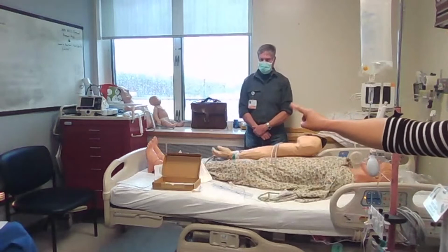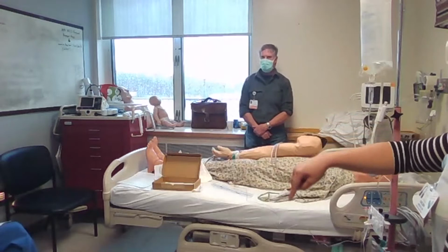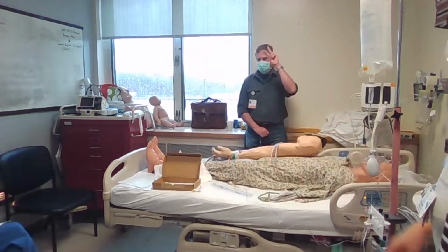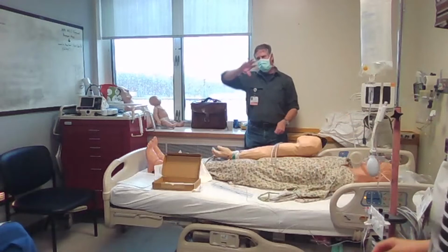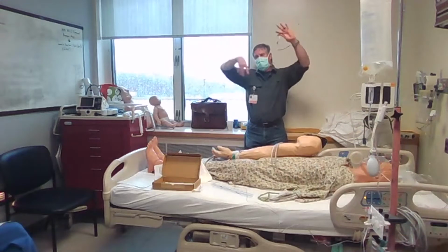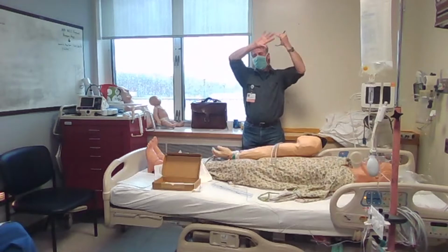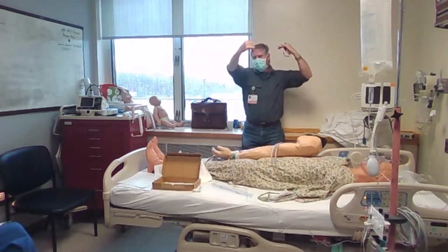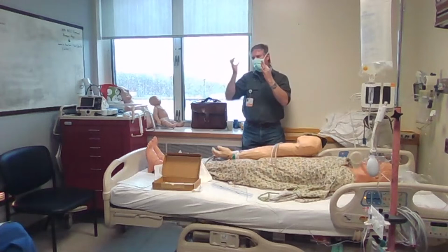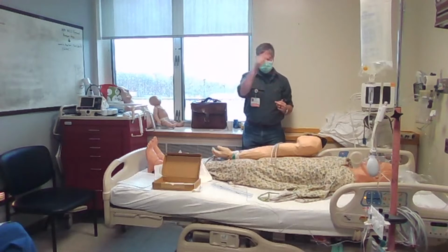The only monitor that we have, I don't know if the ER has one in storage somewhere. Okay. We have two in anesthesia, if you're in a pinch. Yeah, absolutely. They're in our workroom, there's a shelf, right after you walk in, to the left. It's on the top, a big yellow bin with a plastic, just like the plastic code trays. They're perforated in the middle. It's got one, I call them bricks, some people call them brains. They're those little modules that you plug into. It's got one of those, and it's got two of the cables.